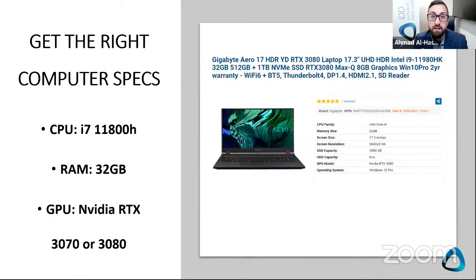That's one of the single most important things you can do, because Medit and these USB scanners are not like CEREC and Trios that come with a computer. A lot of these USB scanners, you just buy the scanner, and I'm sorry to tell you, but your practice PC, the dusty old office PC, is not going to cut it. You need really hardcore machines. So even when you're budgeting for the scanner, you need to budget for another 2,000 to 3,000 USD on a decent laptop. This laptop is about 7,000 New Zealand dollars, but it will definitely change your life.